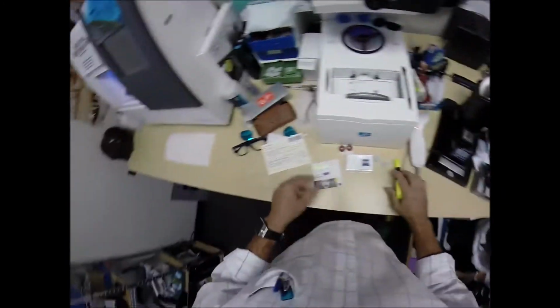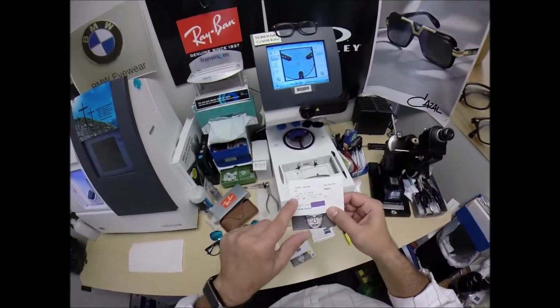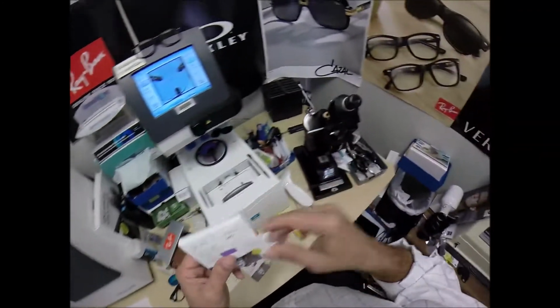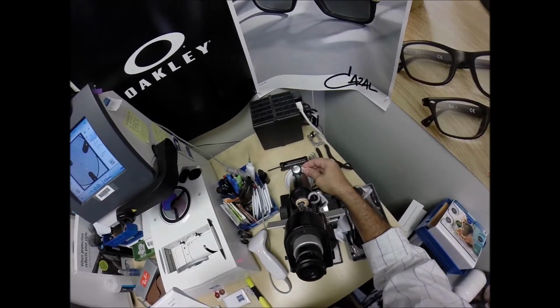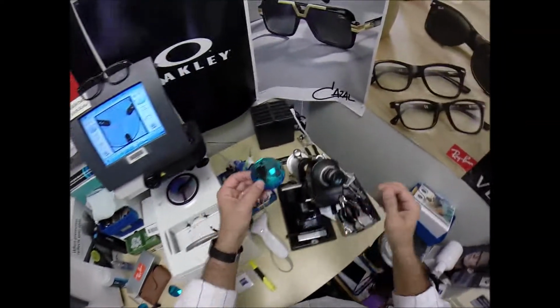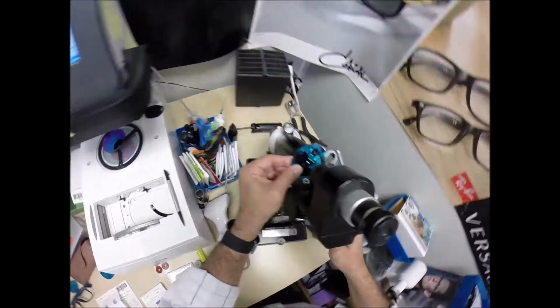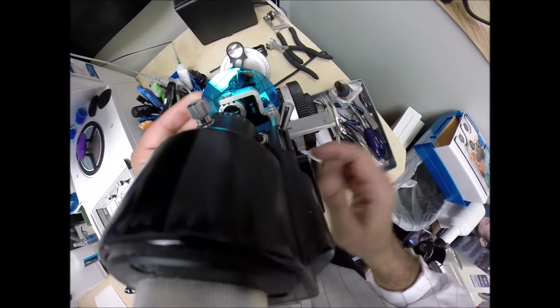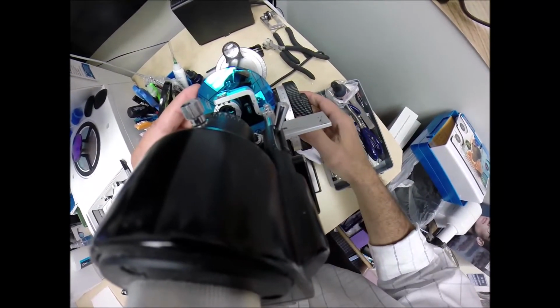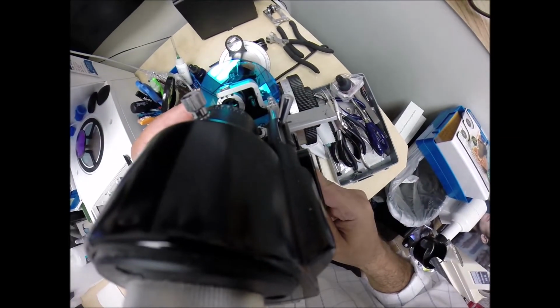And let's do the same thing now for the left lens, which the power is -2.50, -0.75 at 180. Turn that to 180 degrees, which will beplano (zero) in this video. Put the power drum on -2.50, take the lens out of the protective packet. Spin the lens until the spherical component comes into view first. Get everything centered. Check your astigmatism correction. -3.25, we're doing good there. Everything is perfect. Always like to double check everything.